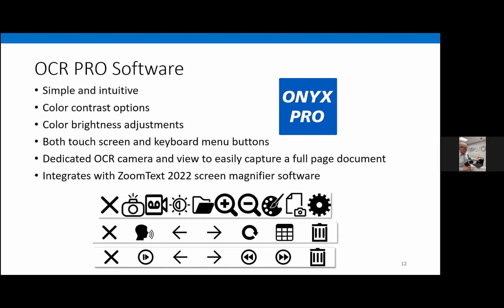And what's nice about having the stand and the ad hoc camera this way is if the student doesn't need the camera in a particular classroom, this doesn't have to come out. And what you see here with a keyboard on this is something that isn't terribly out of place in a school setting. Should the student need the accommodation of the camera, you can simply unfold it, take it out of the case, put it in, plug this thing in, and what we have now is an inline system where my documentation is directly under the camera.